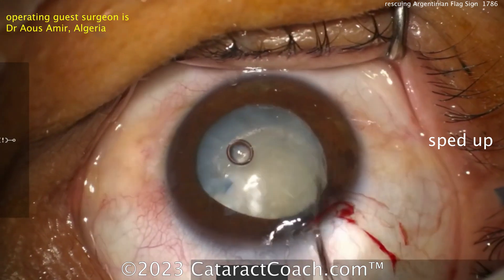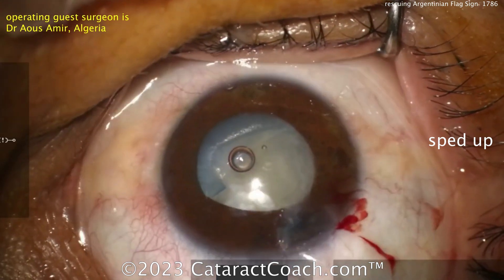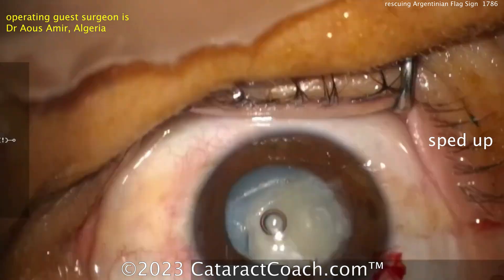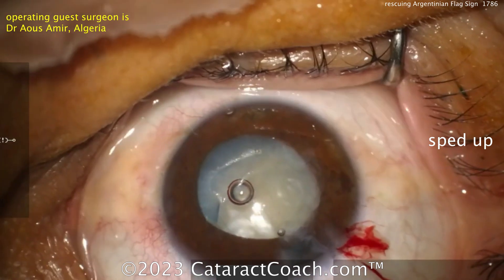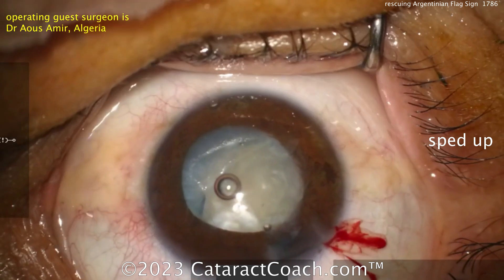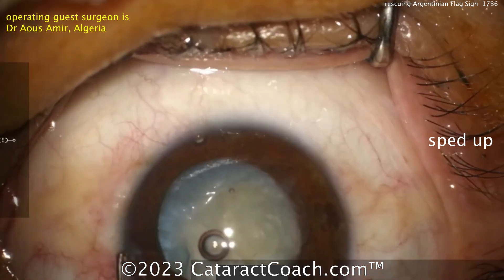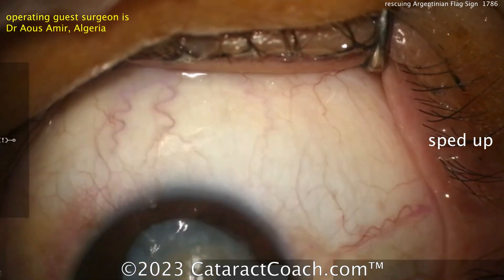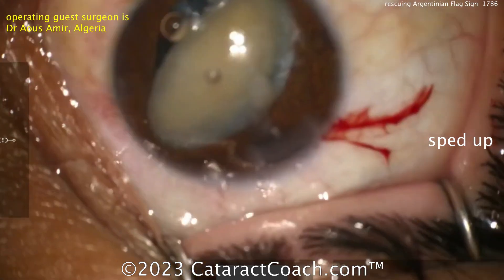A chopper going inside — let's see what we're going to do here. Rotate it a little bit, maybe bring it up. More viscoelastic — always a good thing. The video is sped up; we just want to get the whole thing done in about five minutes. At this point, I'd want to enlarge the rhexis a little bit more and then bring the nucleus up out of the bag. I don't want to operate in the bag too much.